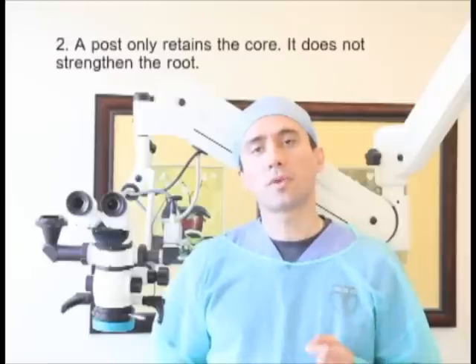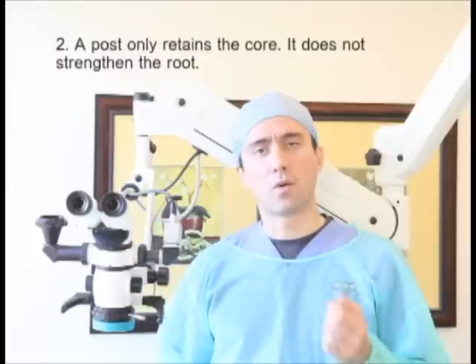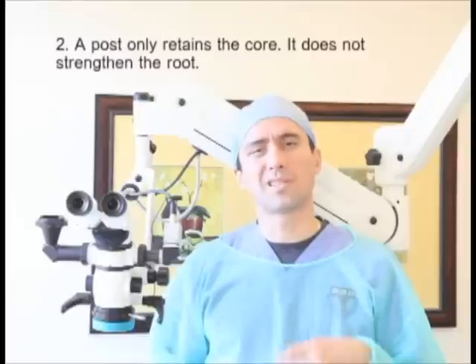Second, it is important to realize that the function of a post is merely to retain the core. A post does not strengthen the tooth, and ubiquitous use of posts is remnant of the non-adhesive days of dentistry. Today, where bond strengths surpass the cohesive strength of dentin, there seems to be little logic for the use of posts, especially in molars, where bonded cores appear adequately retentive. This is why the EndoSequence post system is designed more like an interradicular core buildup with a rebar than a true post system in its traditional sense.